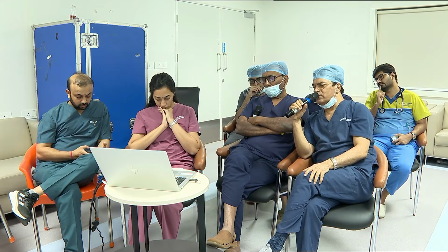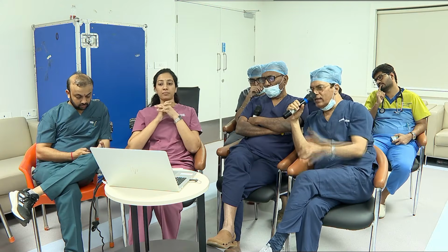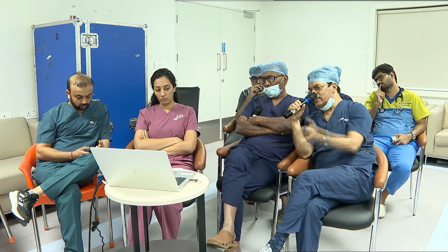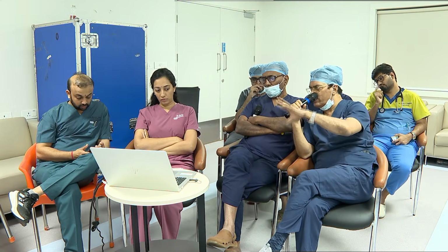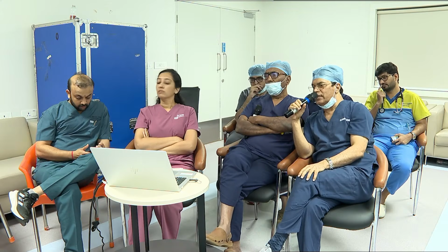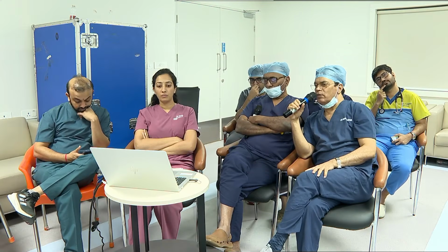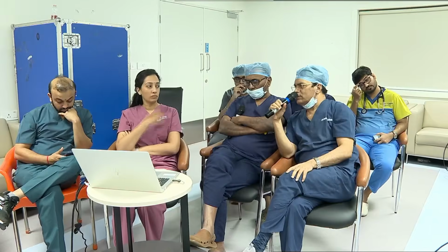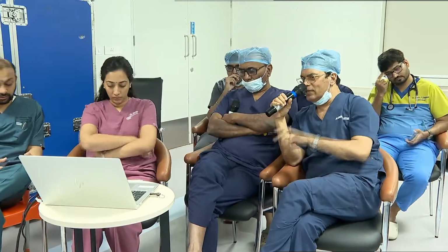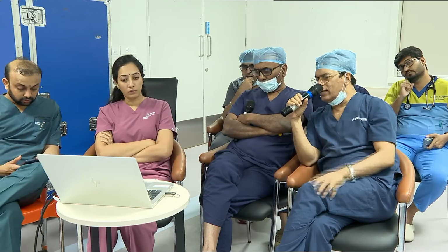And timing of the pacemaker is very, very crucial. So when you switch on the pacemaker, until the pressure drops, that time only you have to implant, and see that the pressure is low until you deploy it fully. After that, you can switch off the pacemaker. Otherwise, one of the most undesirable effects of the balloon expandable valve is embolization. It can embolize easily. That's the reason you have to maintain low pressures. You see that the pressure is not very high. If these are there, again it can embolize.